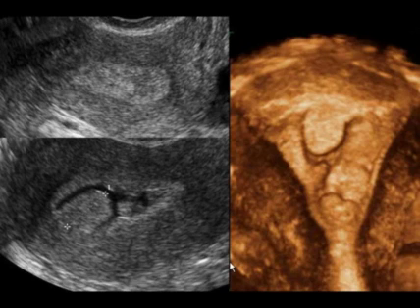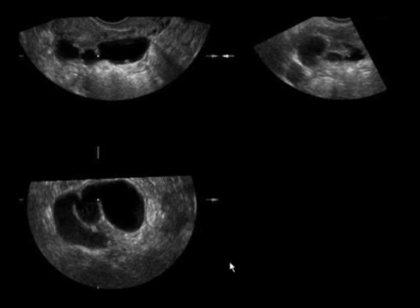Now, looking at the adnexa, 3D ultrasound is also very helpful in the adnexa. In this case, we had multiple cysts in the adnexa. Is this a hydrosalpinx, or are these multiple cysts? And sure enough, in the reconstructed view, you can see that this is a hydrosalpinx. The hydrosalpinx is in a plane other than the planes that we could image in, but it certainly was a plane that we could reconstruct.